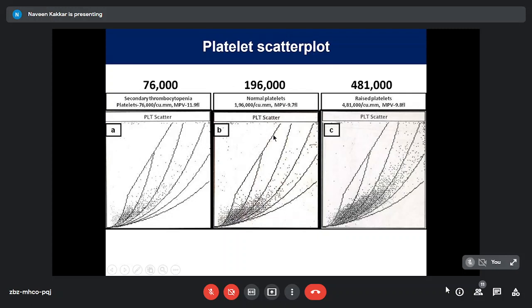The thing to notice is, irrespective of the platelet count, normal, low, or high, in the scatter plots of the 5-part, this is the Advia analyzer, you see a density in the lower part. That's there, that's here as well, and here as well. There are some small dots on the upper larger volumes, but there's a density that you see, although the density is less obviously in the thrombocytopenic patient, medium, and more in this, but there seems to be a grouping of platelets in the lower zones. That's an important pattern to remember.